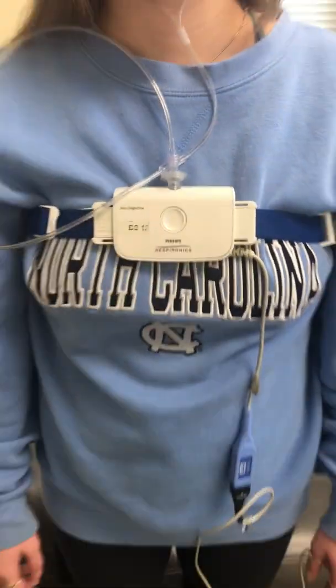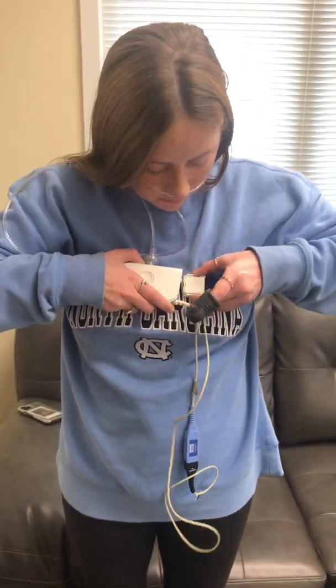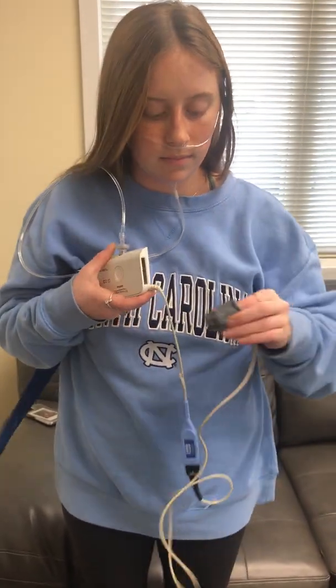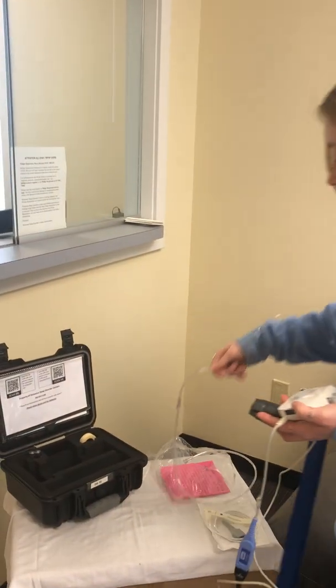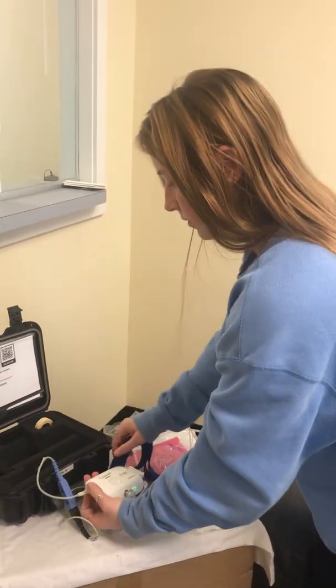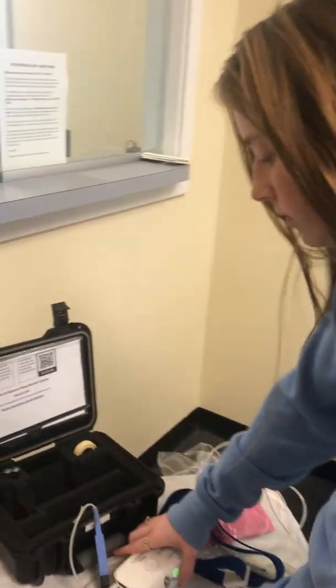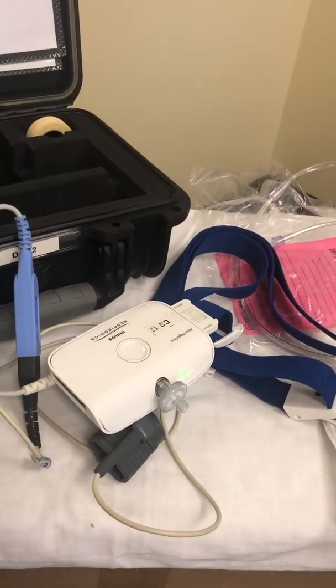When you are completed with your test, simply unclick the belt, remove the finger probe, and take the nasal cannula off. You can then place items right onto the bedside table as needed. The device will remain on but will turn off within approximately 20 minutes.